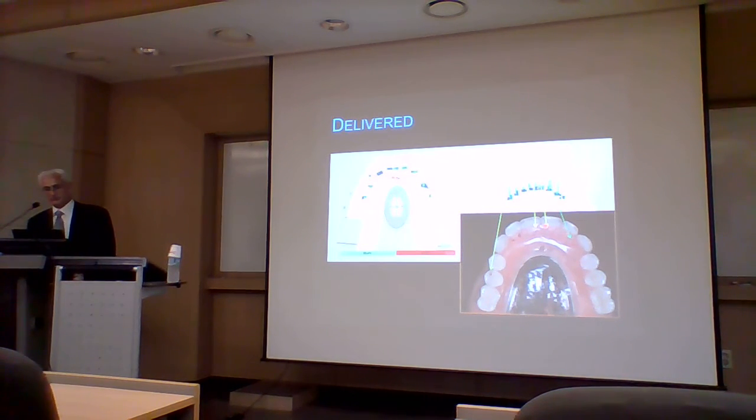And this case probably took 5 or 6 recordings and took maybe 20 minutes to do with the T-scan. And where the ERA and the natural root are slightly more force than the rest of the prosthesis.